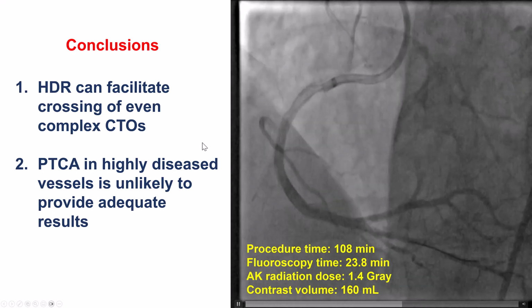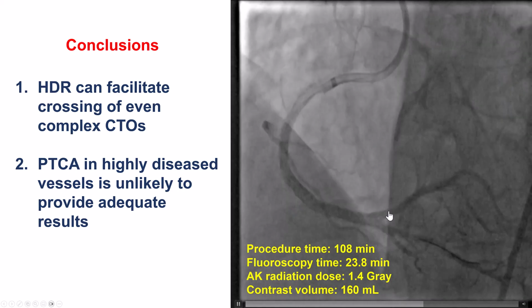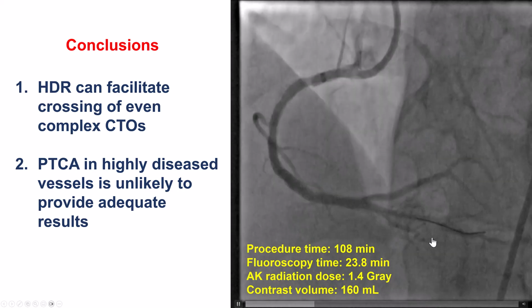And then the second point is that balloon angioplasty alone may not be enough, especially when there is diffuse disease and there is in-stent restenosis, as was the case in the posterior descending artery.